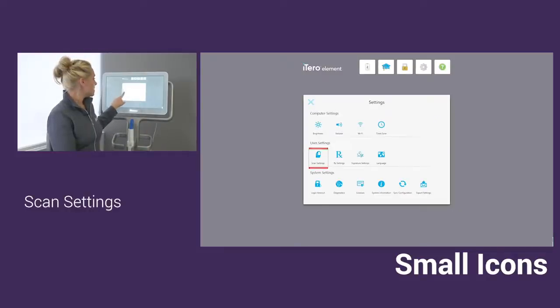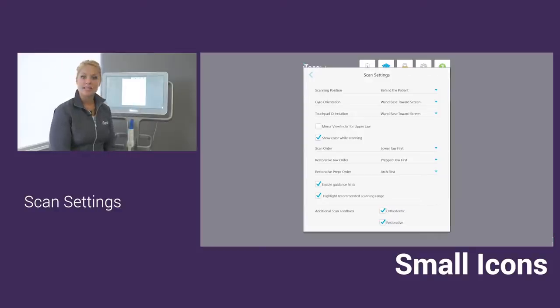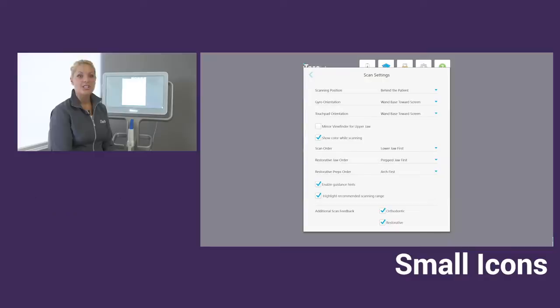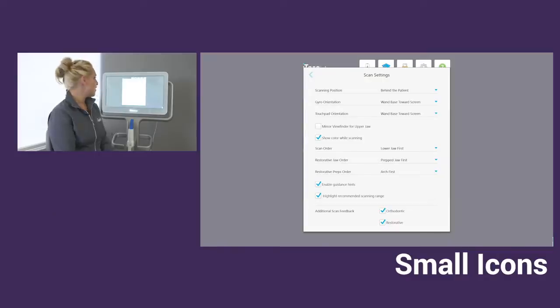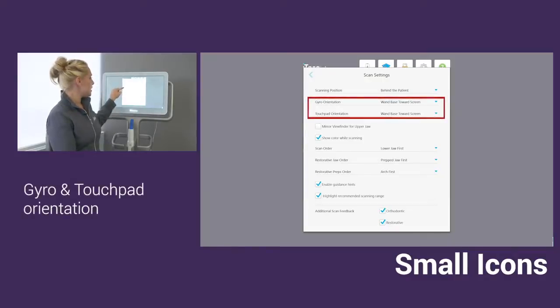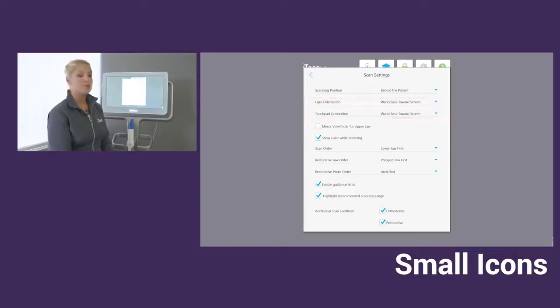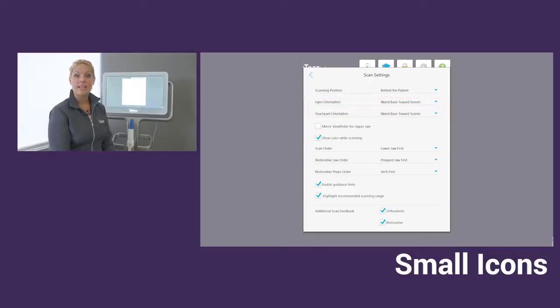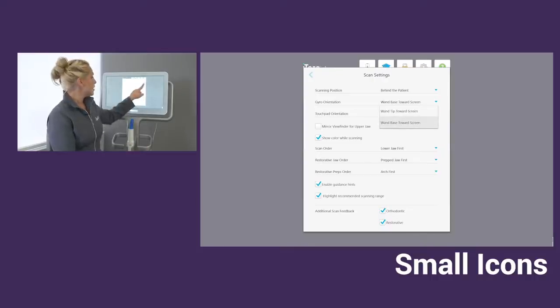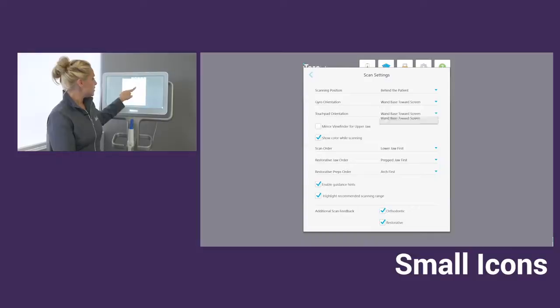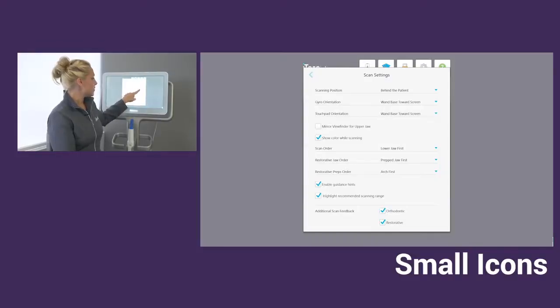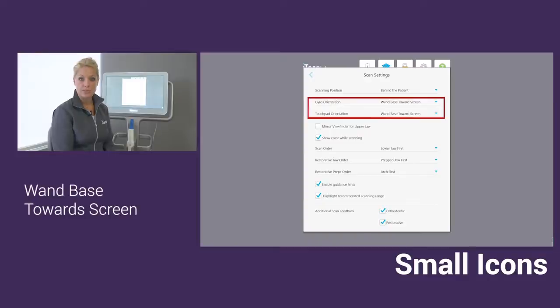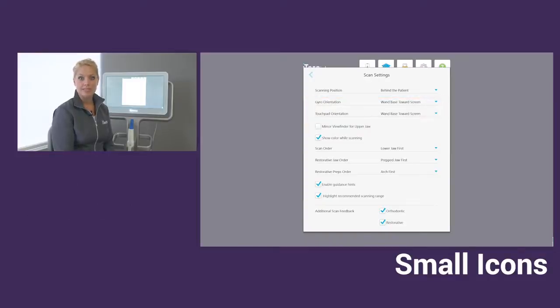Next in the scan settings, I'm going to cover some settings that will make it easier when you are scanning. We have our gyro orientation and the touchpad orientation. They are defaulted to have the wand tip toward the screen. To make it easier to use your gyro feature, you'll want to drop down and change it so it says wand base toward screen. That'll make it easier for when you use your wand to rotate the model and move throughout the different segments.